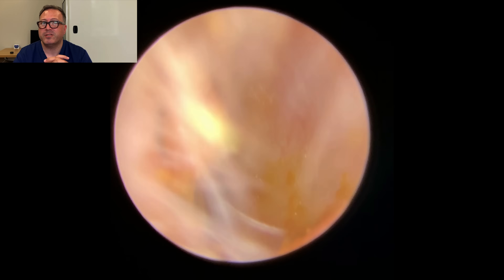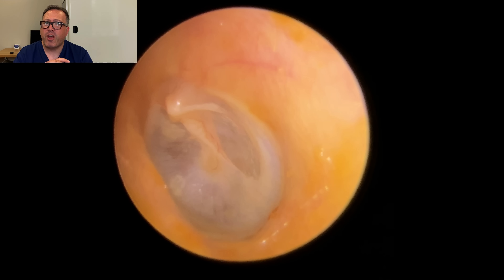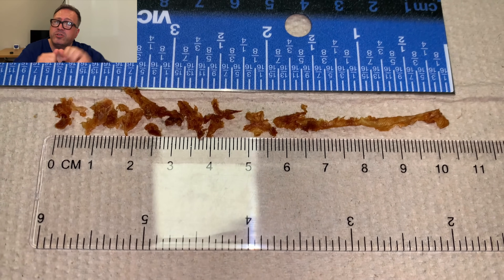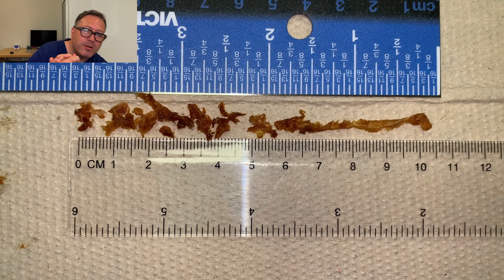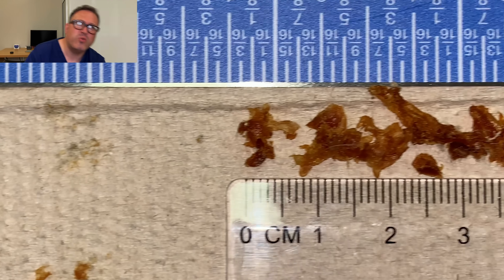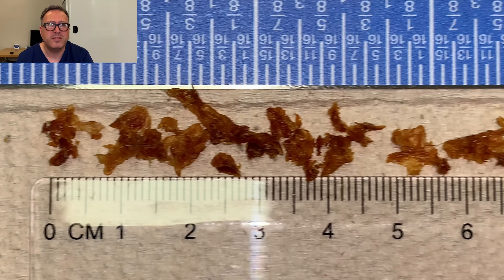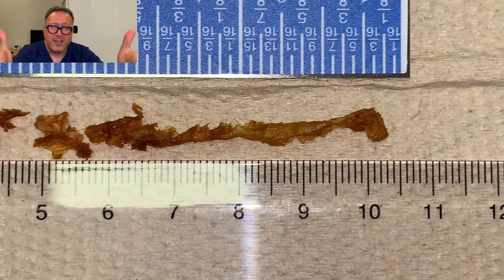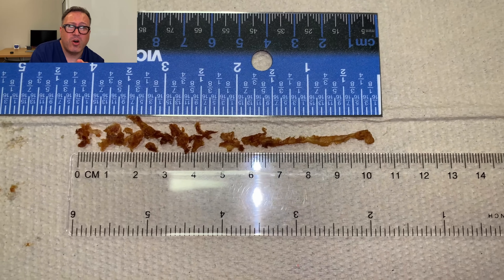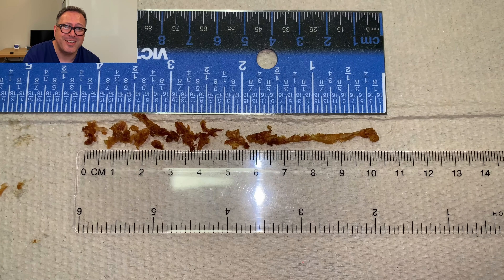Suction now should be able to pull the rest of this through. And there's the eardrum — looking very retracted, very drawn in. You've got your hammer bone in the center section, with two very drawn-in sections either side. So this is what we removed — oh my God. That's about four and a quarter inches — I'll go with inches and centimeters. That ribbon was just under four centimeters — just under two inches in length. That one particular ribbon you saw pull through. Lots of big debris. And don't forget, that came out of two ears — so about 10 and a half centimeters. That is a lot.